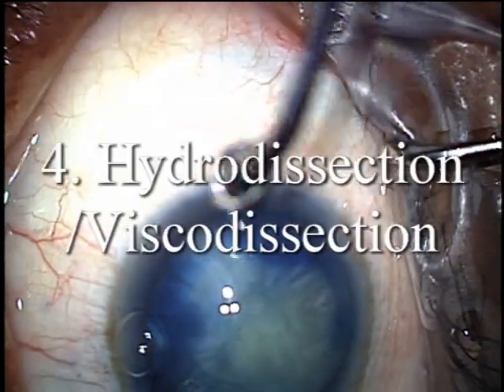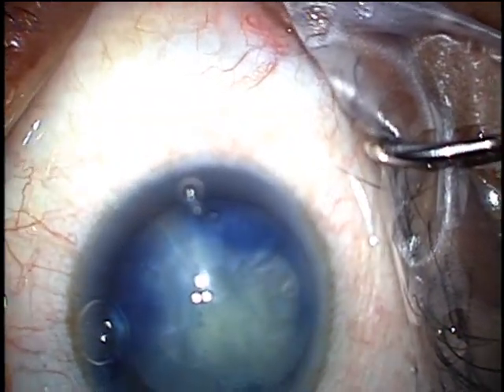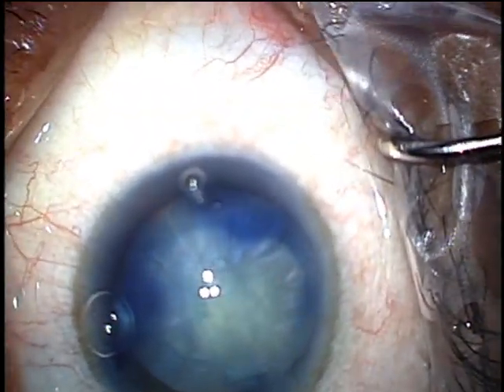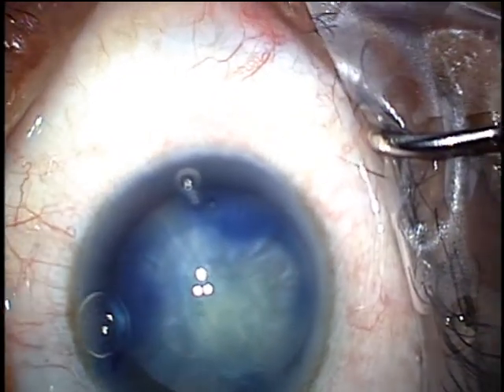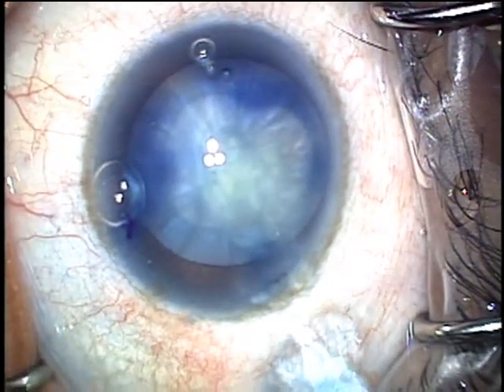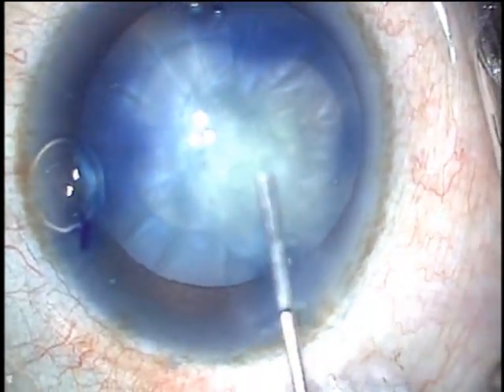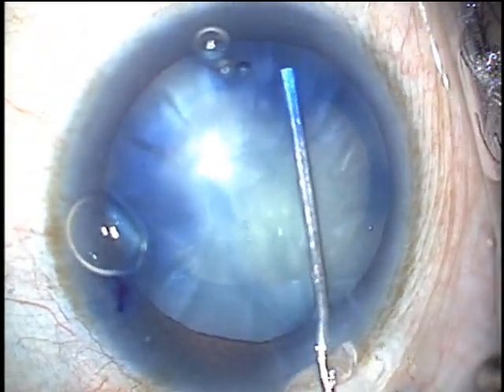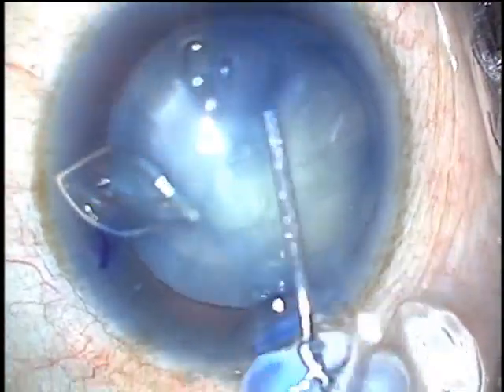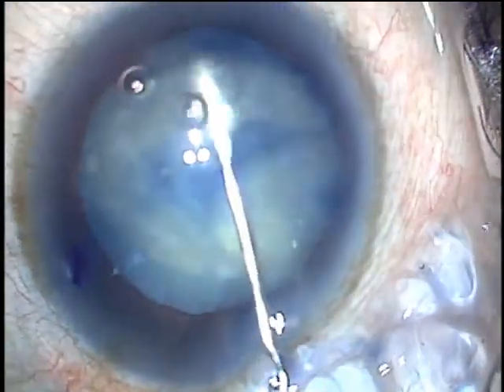Finally, before phacoemulsification, you want to mobilize the lens with hydrodissection and sometimes viscodissection. If you have a lot of cortex, just take a little time to hydrodissect, often from various locations. Occasionally, you will have liquid cortex which you've removed completely, and you're left with a dense white wafer-like nucleus.